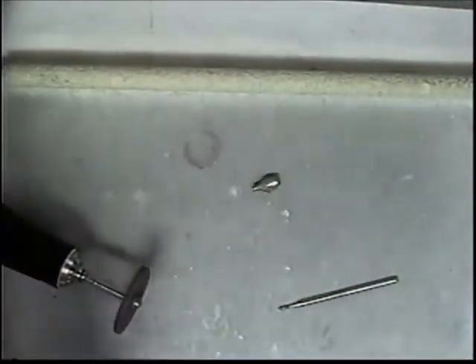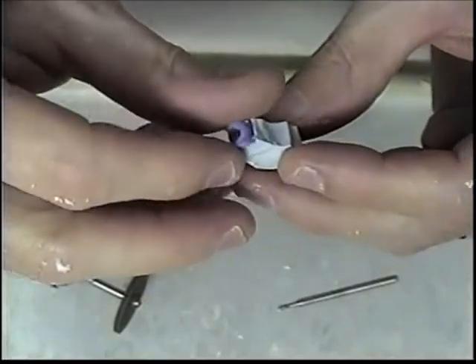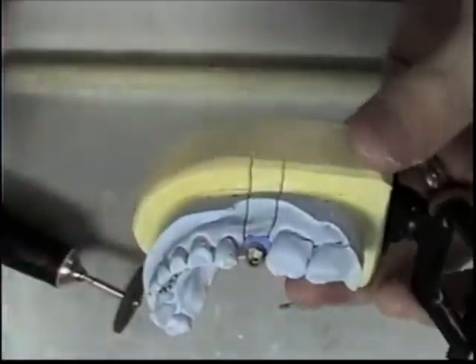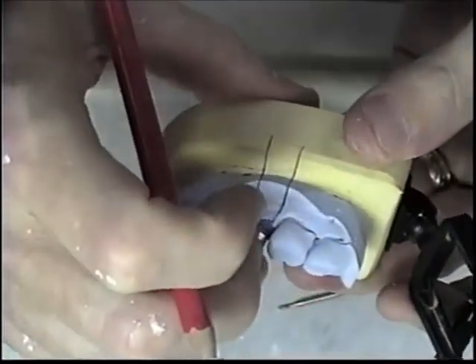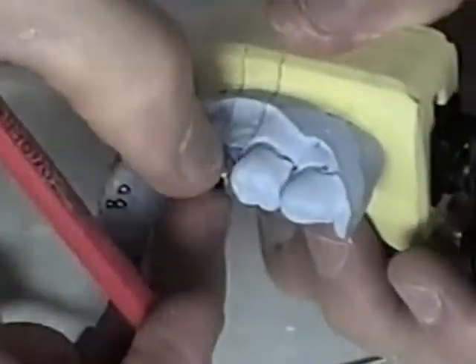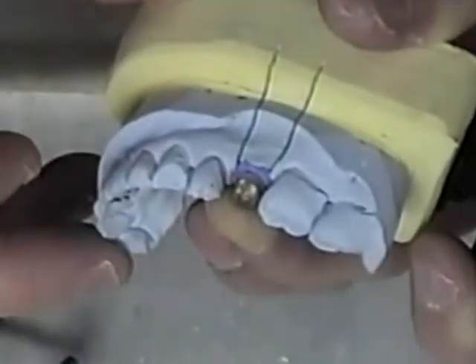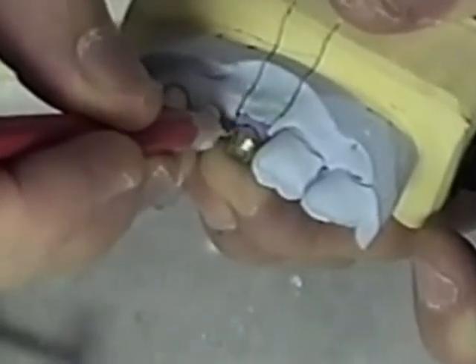So I'm going to seat this onto my die. I've put my abutment back into my model and found the placement of it the way that it was waxed. So I'm going to start creating my margin, and I want this margin to be about a half millimeter subgingival.